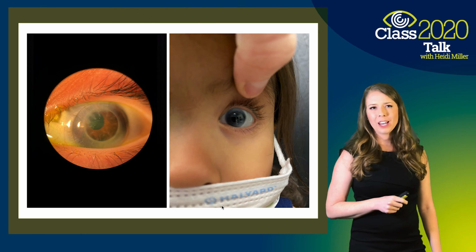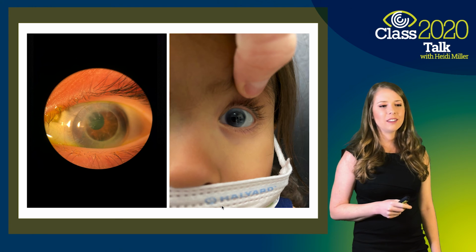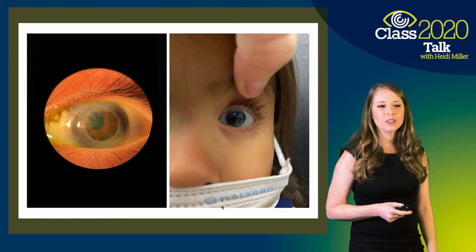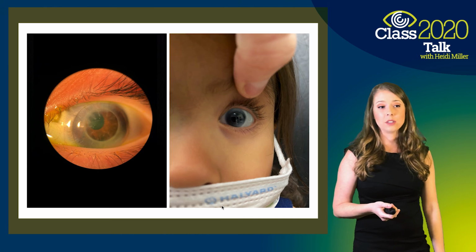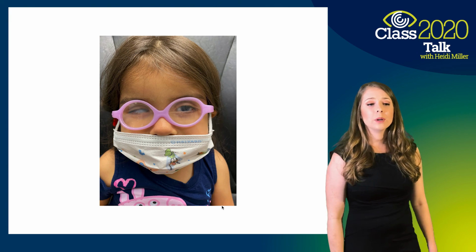It was difficult for me to get a photo with the fluorescein in the dark. I couldn't get a very great photo. It was difficult that day, but I did with the light, and you can see it's doing great. And I was trying to show you the centration there and the size of her overall eye. But she does wear overlay protective glasses.